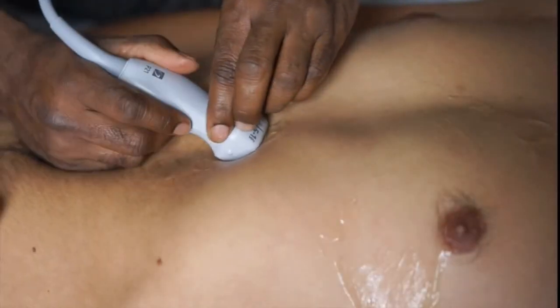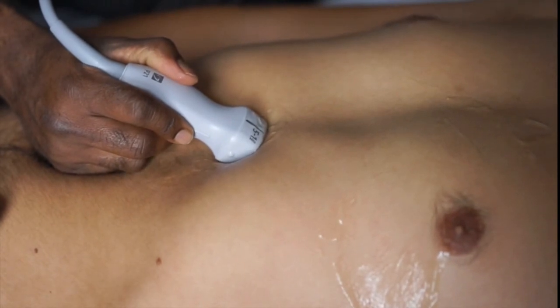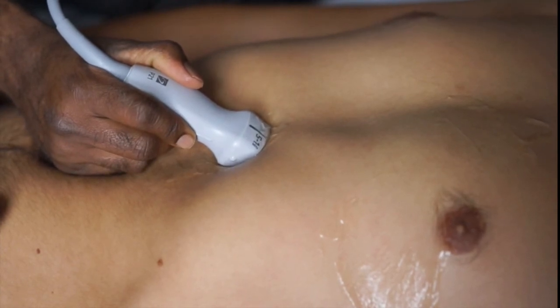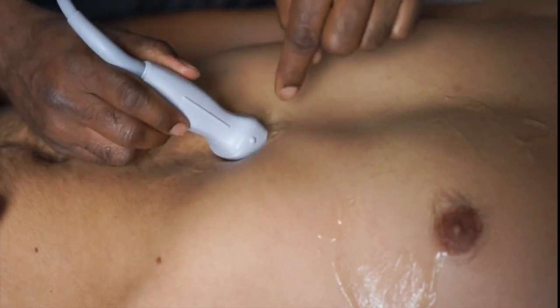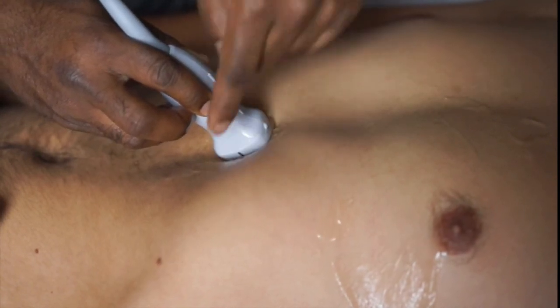The next view is the subcostal vena caval view. Now vena caval view is obtained by placing the probe facing towards the patient head with the index point pointing up. You may also obtain this view by rotating the probe anti-clockwise around 90 degrees from the subcostal 4-chamber view.